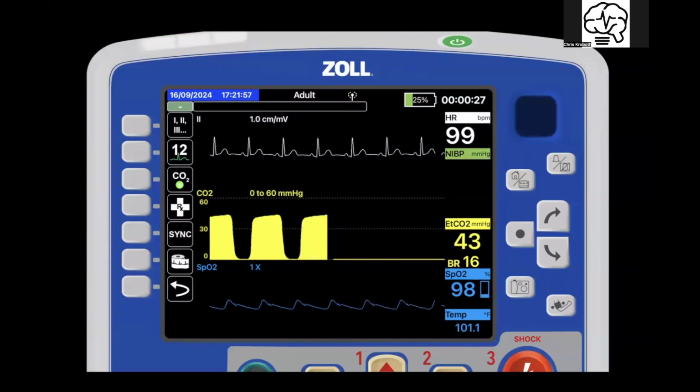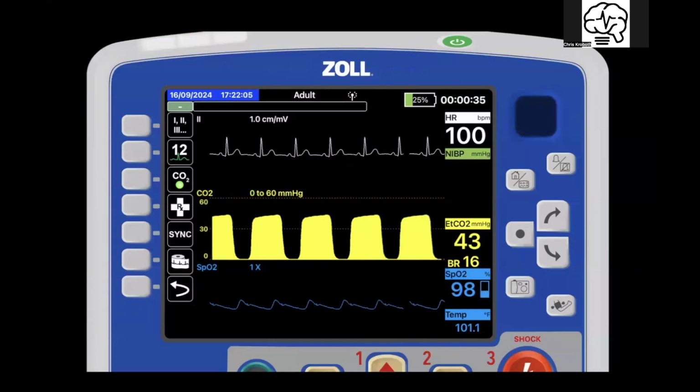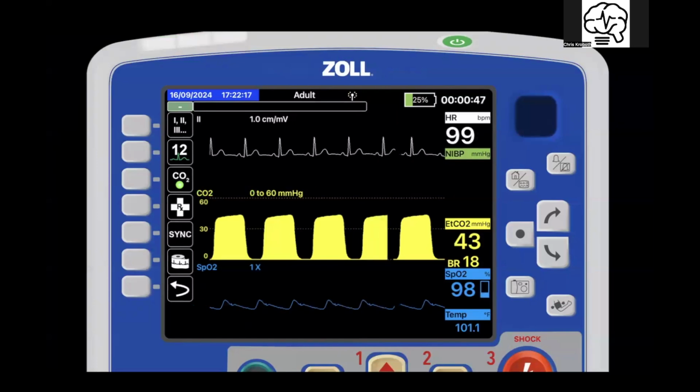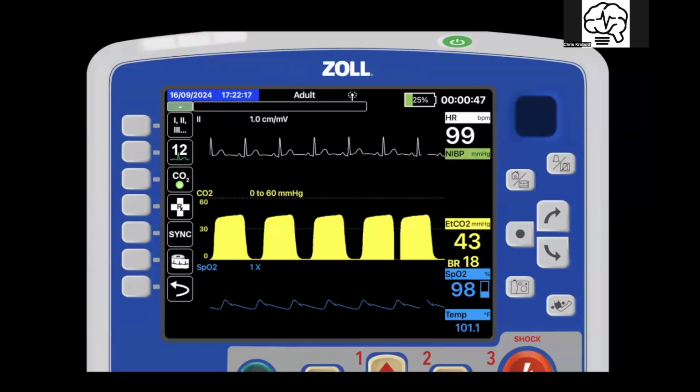So you'll see a high or upper end of normal end tidal value along with tachycardia. They're ramping up, generating heat for the temperature, stress response, cortisol is being released, glycogen's being broken down, increased sugar to sustain this. You'll start to see them breathing on the faster end of normal. Really, once we start to get that rate above 20 on the respirations is when we start to think that they're transitioning to a worse degree of sepsis.